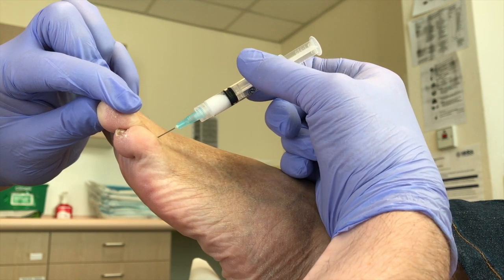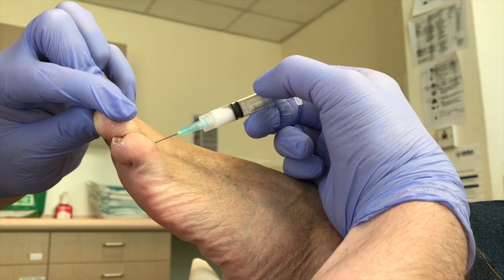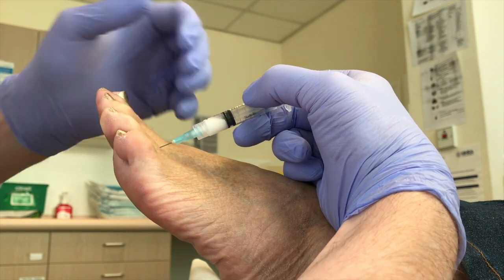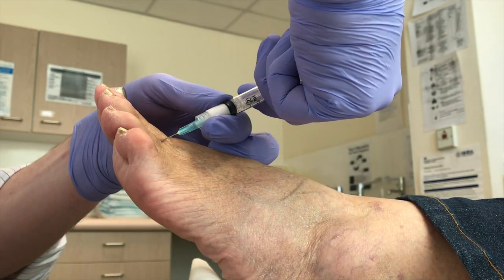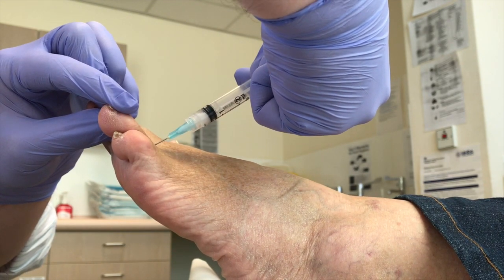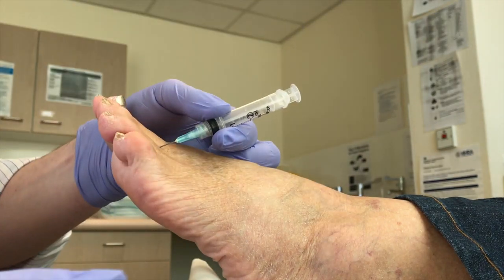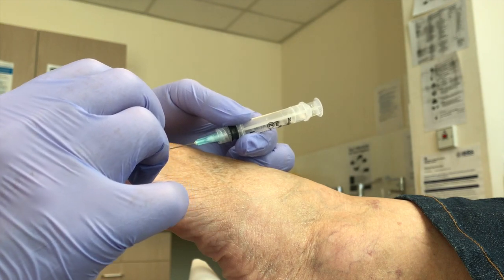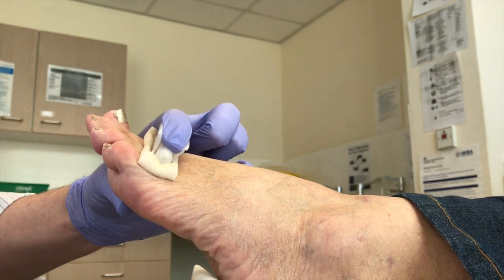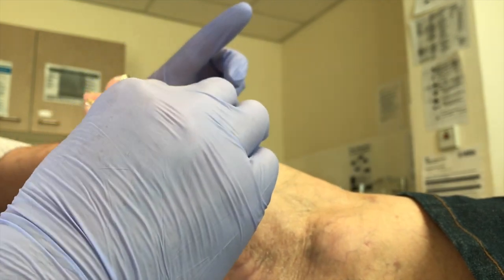So let me know when we get a little bit of a neuro or an ache. Anything in there? No. Okay, so don't need to aspirate on these. And always what happens when the video is going, somebody's going to come in — that was the door in the background. And then we're going to take that out gently. Have a look and see how much bleeding we get. Okay, a little bit. So we're always ready to put a bit of a plaster on. A bit of pressure, we'll see how much more bleeding we get.